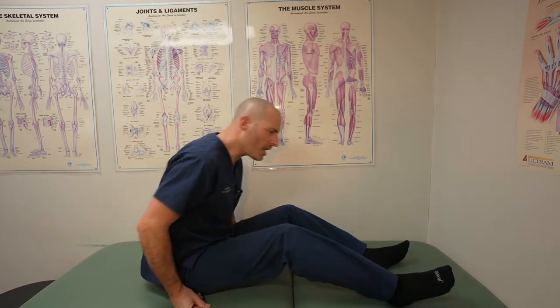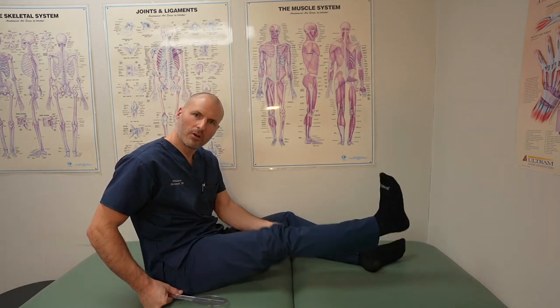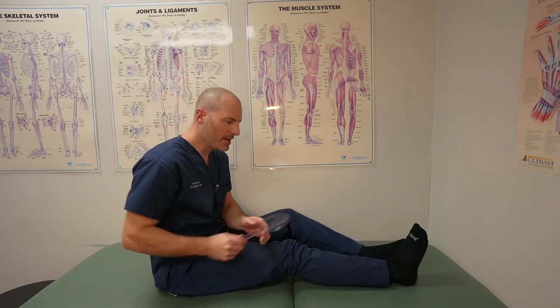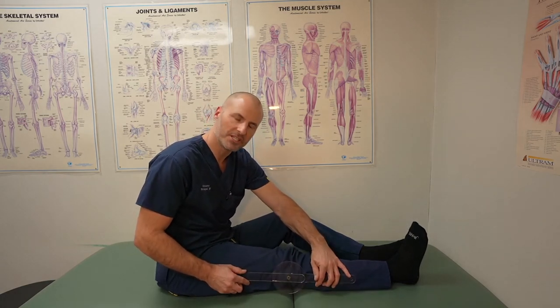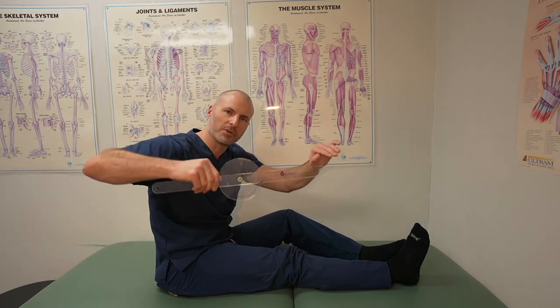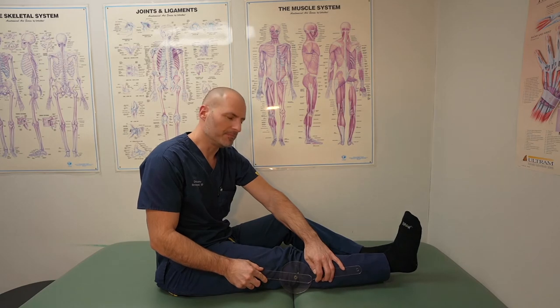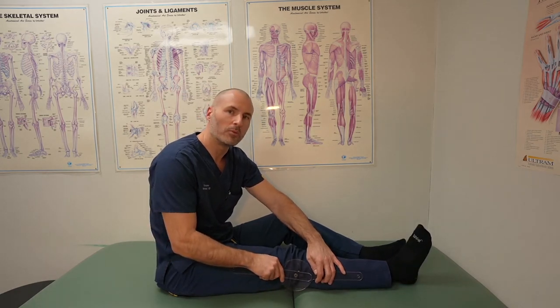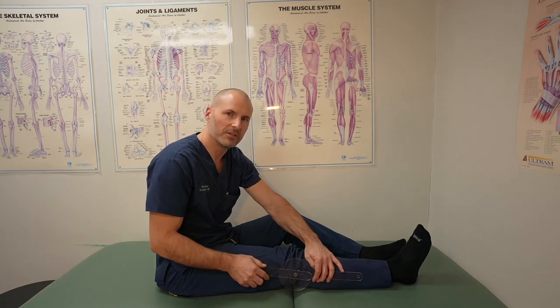When I talk about extension, I'm talking about how far the knee will go in terms of straightening. Ideally after knee replacement surgery we'll get you to full extension, or zero on a goniometer — that means a straight line. A normal knee might actually hyperextend a little bit, and while that's normal for a natural knee, we don't try to have that occur after knee replacement surgery as it can create instability.